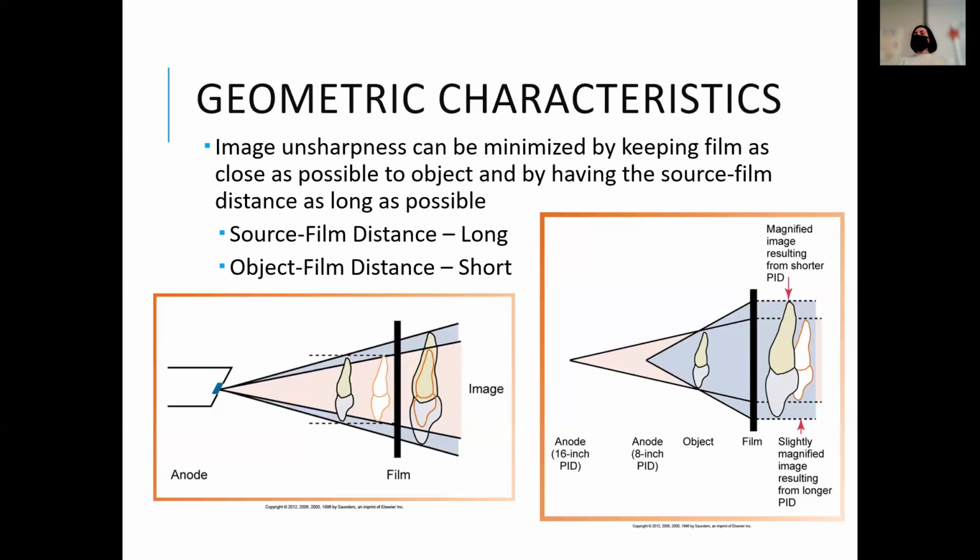The reason for this, and this will help a lot when you actually play with the tooth and flashlight in lab, you'll be able to see this concept. When the target is farther away, you get this spanning. Now, wait a minute, what are we looking at? Sometimes these pictures throw me.